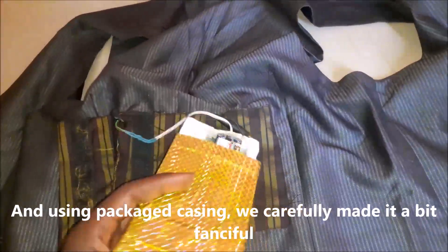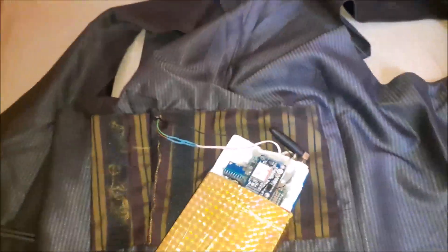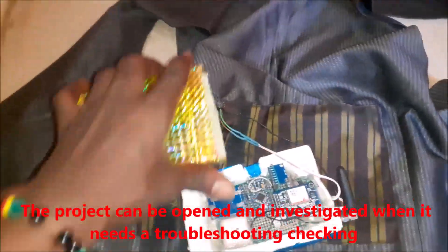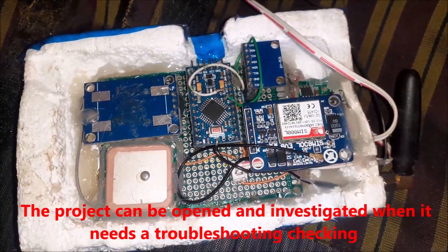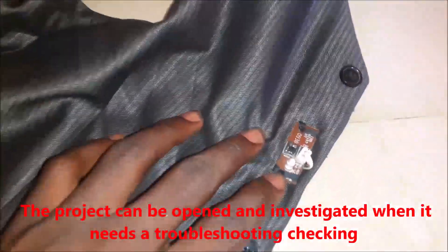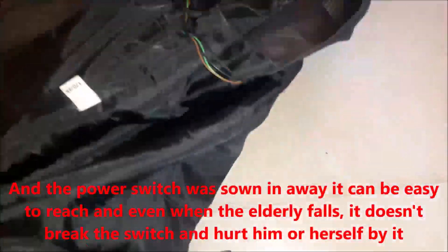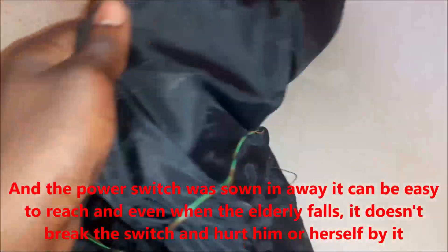The whole setup is cost friendly and doesn't need much apart from scraps you can pick around the house or office. This enclosure casing made it possible to troubleshoot the prototype if there happens to be any problem. The project can be opened and investigated when it needs such troubleshooting. The power switch was sewn onto the jacket in such a way that it is easy to reach, and even when the elderly person falls, it doesn't break the switch and it doesn't hurt them in the process.